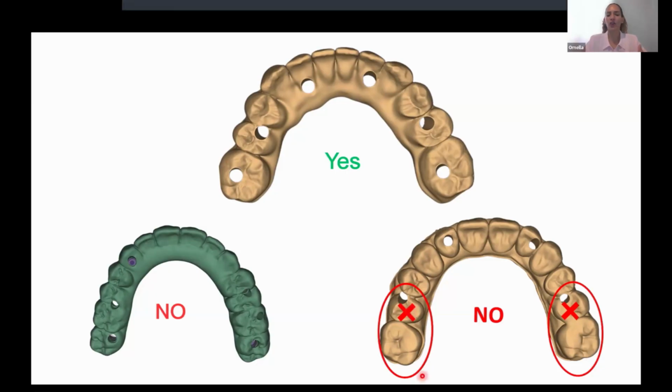In case the patient doesn't smile too big, because of the aesthetic, we can modify our design, removing the premolar, for example. I could leave 1 molar in cantilever and I could work in a monolithic way, okay? In this case, it's possible.